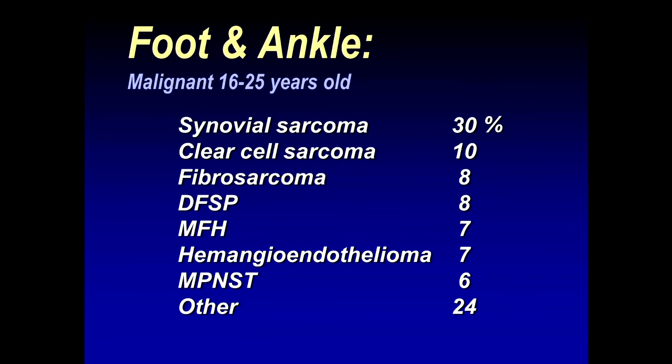And so what I like to do is, if I'm not sure what it is, I look at the literature and say, okay, well, let's go through the list. The most common lesion would be a synovial sarcoma. Is that good in this case? And I say, well, yeah, it is. They tend to be deep. They tend to invade bone, as does MFH. Those are the 2 most common lesions that would invade bone. Yeah, that's a good thought. Is it calcified? That would be helpful on the radiograph. No, it wasn't, but that's still statistically my first choice.